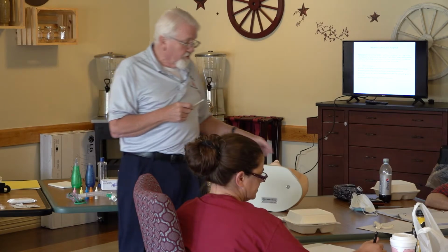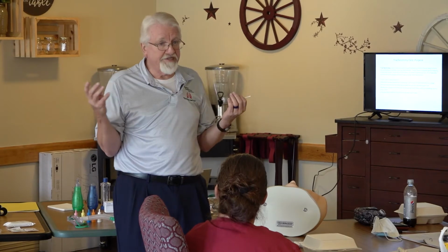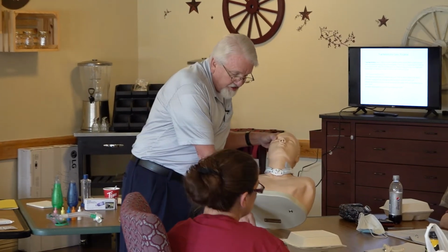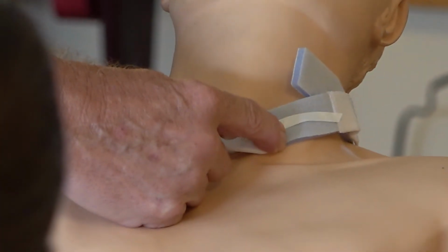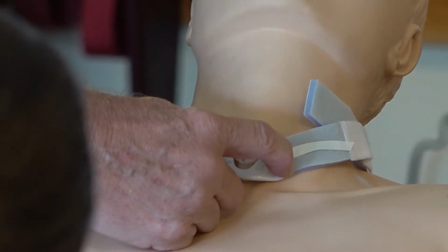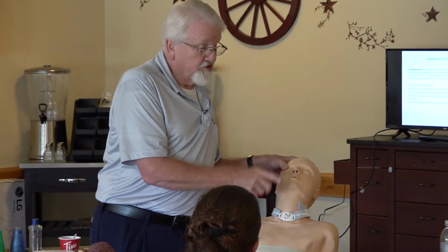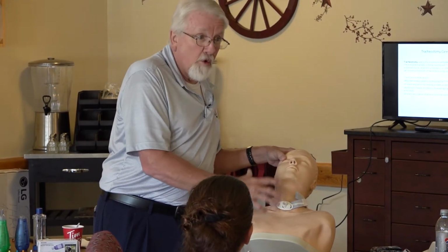The next process is going to be, I split the stoma into quarters, so I have 4 pieces of the pie, and I'll use 4 Q-tip swabs. And when I say secure the flange or secure the trach, it's not that. If you do that, you're just pushing the trach into his throat a little bit more. And if there's not much clearance there, you're pushing the trach against the back of his airway, and I guarantee you 100 to 1, he's going to start coughing all over you until you let go. And then he gets back to norm.